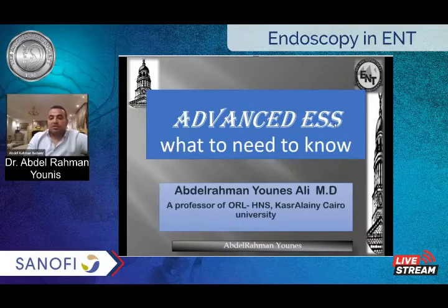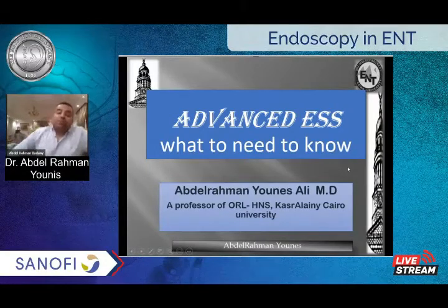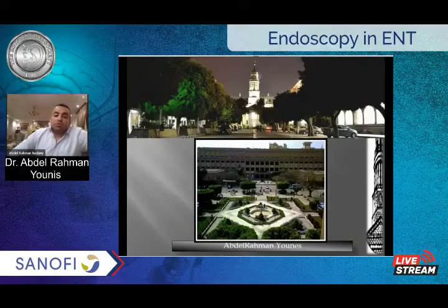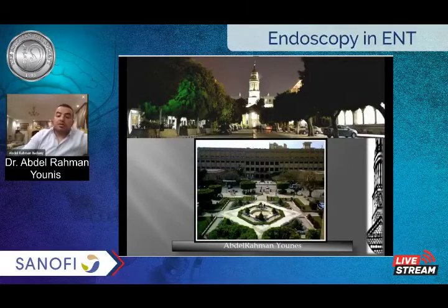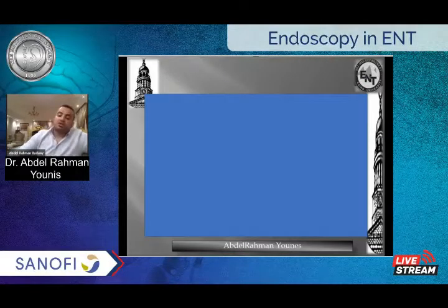My presentation is about advanced endoscopic sinus surgery. I'm honored to be one member of this old medical school, one of the oldest medical schools in all the Middle East, at Kasr Al Ainy Hospital, Cairo University. Advanced endoscopic sinus surgery is a transitional zone between endoscopic sinus surgery and skull-base surgery.